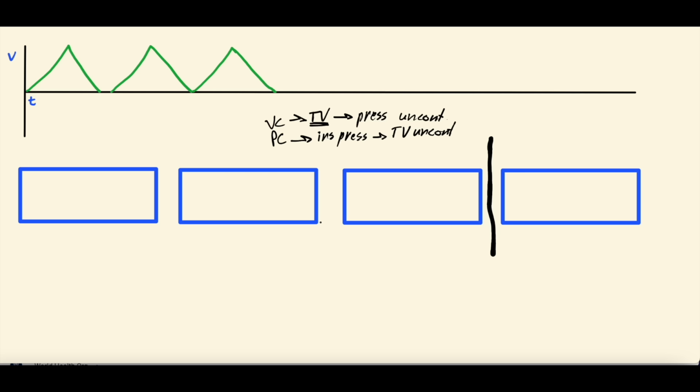So what this means is there's kind of 4 main settings on a ventilator. There's certainly many more, lots of complexity there. But the 4 main settings, 3 are shared between these 2 modes of ventilation. And that is PEEP, or the positive end expiratory pressure. That is the FiO2, or the fraction of inspired oxygen, and that is the respiratory rate, or how many breaths per minute the ventilator is delivering. And these 3 are on both volume control ventilation and pressure control ventilation. And you're choosing these. You're saying, I want a PEEP of 5, an FiO2 of 60%, a respiratory rate of 20, or whatever you choose.